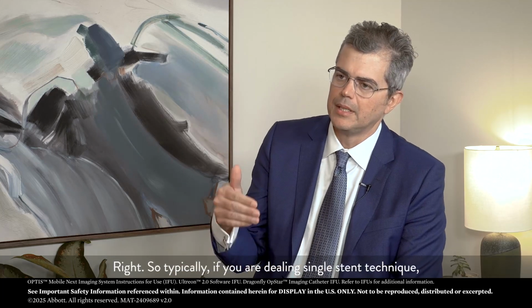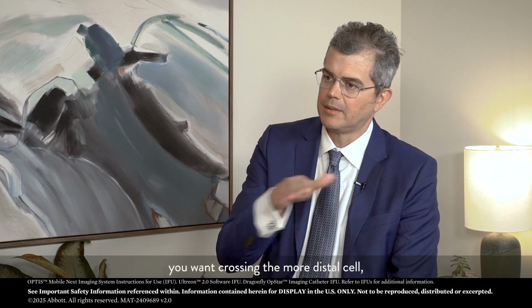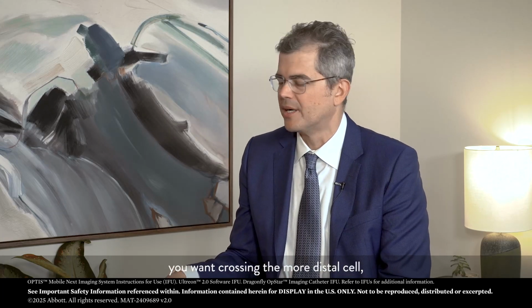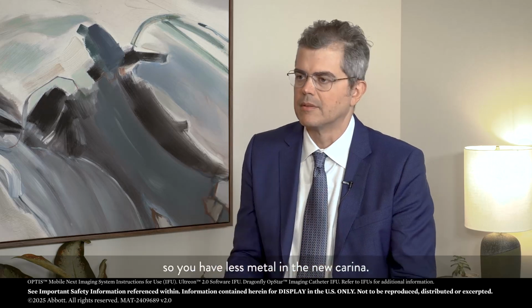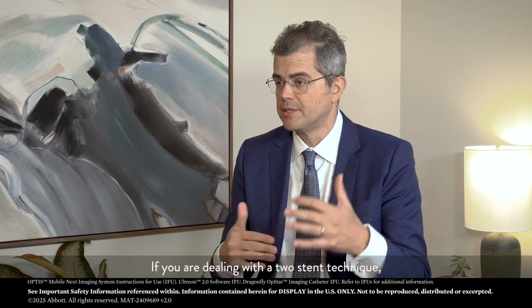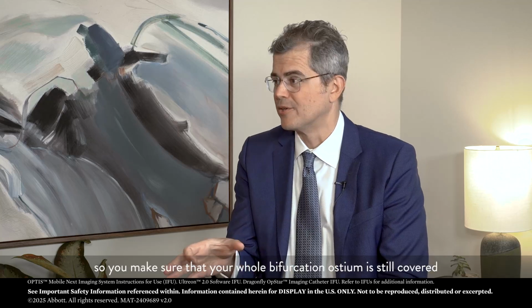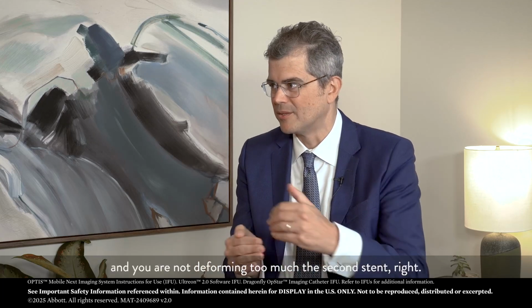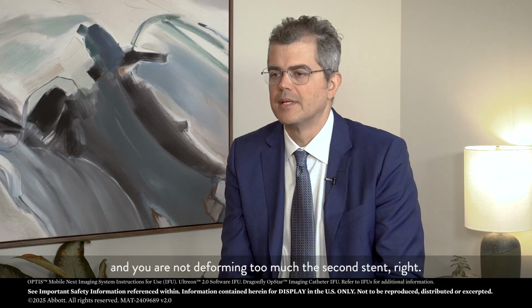Typically, if you are dealing with a single stent technique, you want to cross a more distal cell, so you have less metal in the new carina. If you are dealing with a 2 stent technique, you want to cross more proximal, so you make sure that your whole bifurcation ostium is still covered and you are not deforming the second stent too much, right?